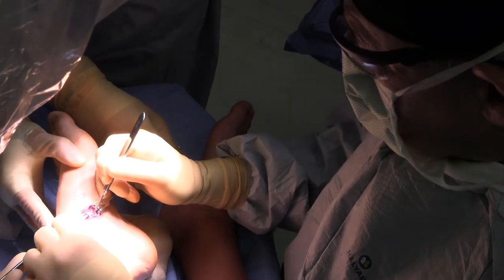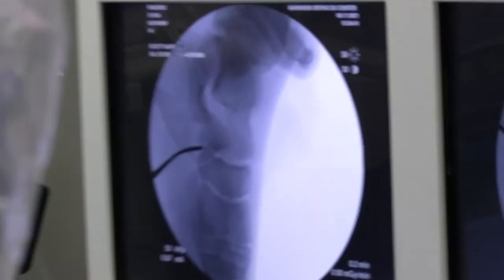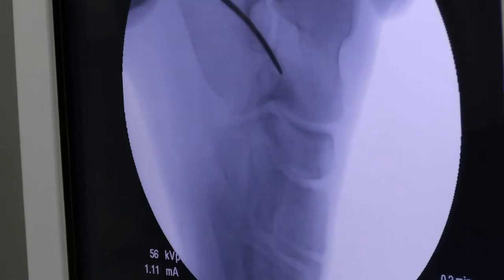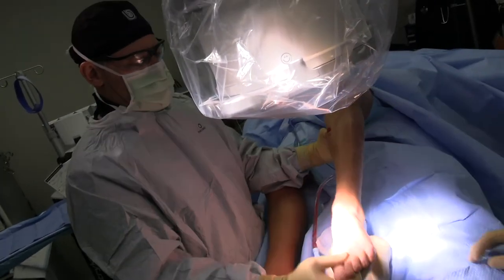We're just going to expose this bone. We're going to take a picture — my freer is kind of in between the real navicular and the accessory navicular. His actual navicular is a little prominent there, so since we're here, I'm going to trim that back just a little bit. I want to make sure that feels nice and smooth. Let's see what it looks like on x-ray.